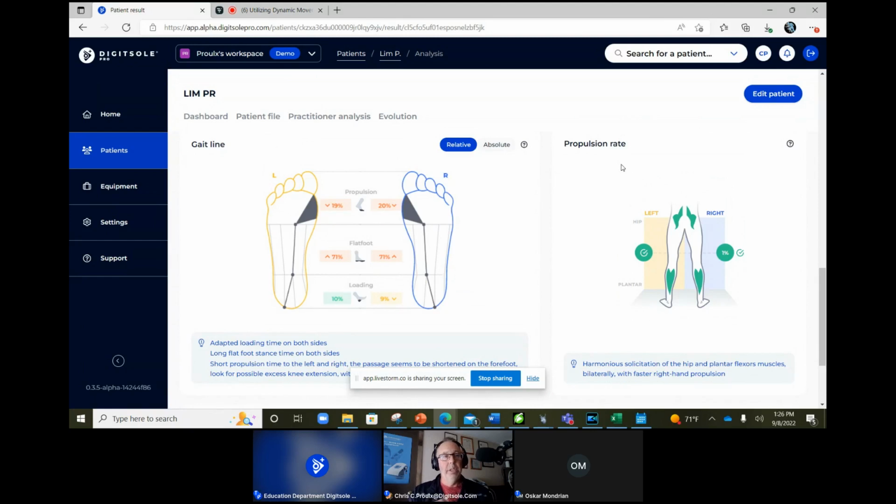So the combination of those two muscular activities generate the late propulsion phase from contact into the early swing phase of the gait cycle. And what we see here is the system says, again, it's green and green, green and green. And it shows us that there's equitable muscle activity between those two groups of muscles that are going to initiate the swing phase.